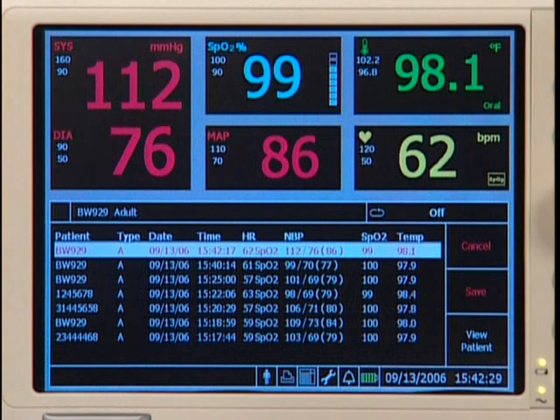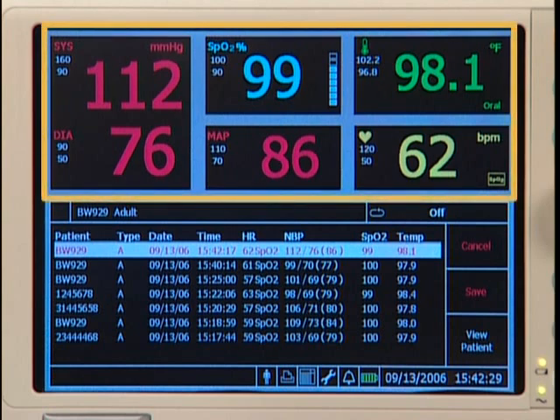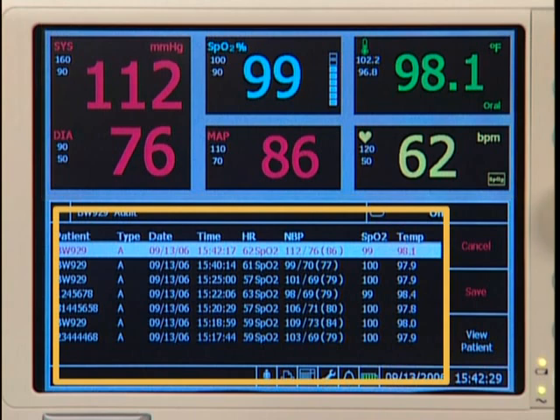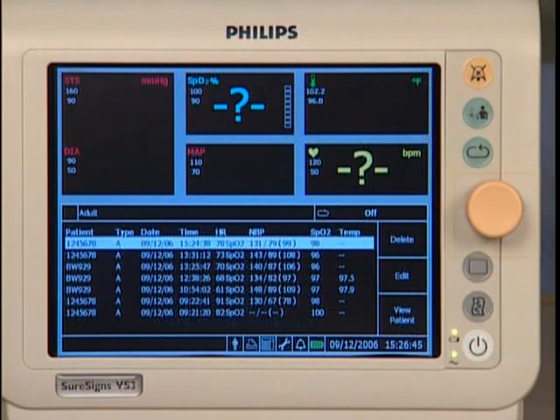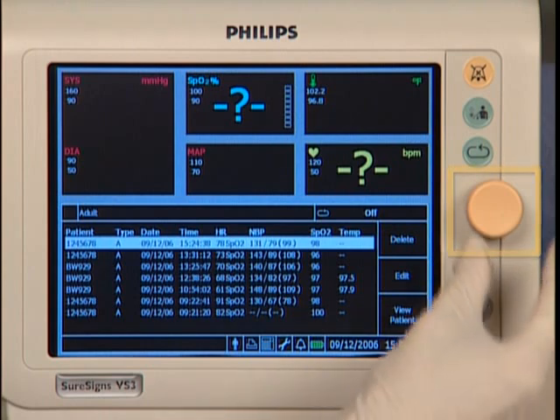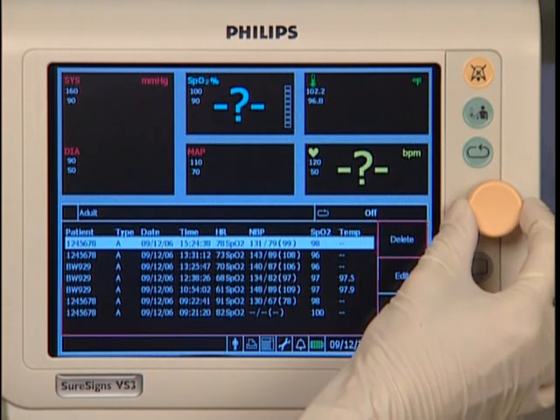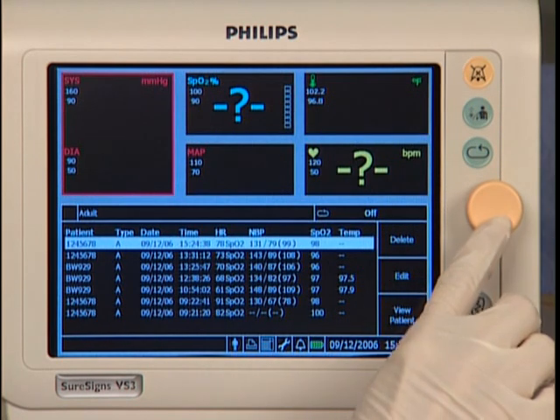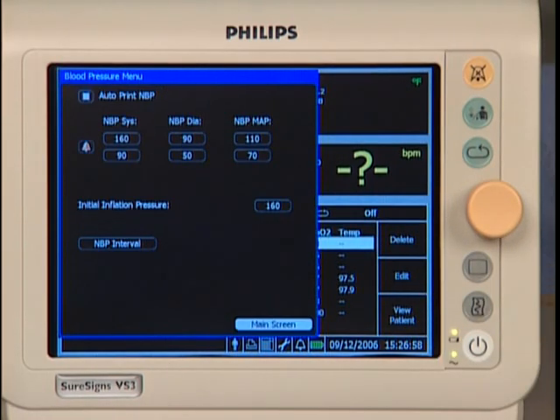Let's look at the rest of the main screen. The screen includes a combination of different panes. These numeric panes contain display icons of each measured parameter, its numeric value, and its alarm high and low limits. Here is the patient records table, which may include up to 400 stored data sets. This is the navigation wheel — rotate it and notice a highlighted area moves around the screen. Highlight one of the measurement panes such as NBP and press the wheel to open the menu associated with that measurement.